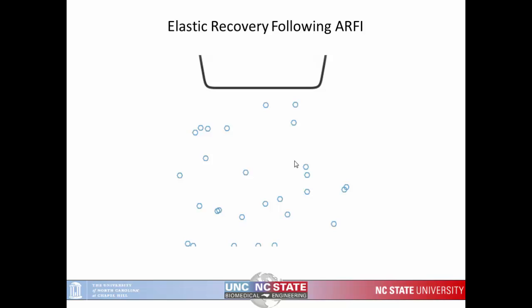So how do we simulate these untethered, extravasated blood scatters? This is a movie showing the ultrasound transducer and a zoomed-in version of the scatters that we are inputting into our field simulation. In a perfect case, when we excite with radiation force, we have displacement away from the transducer and perfect recovery back to 0 if nothing moves. So the scatters will be perfectly correlated from time point 1 to time point end.